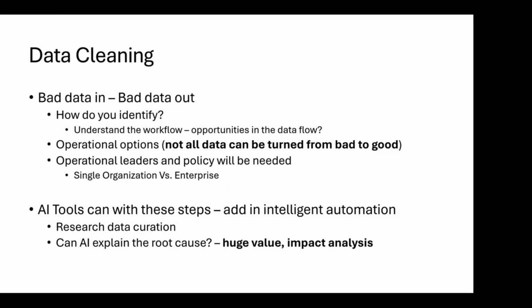Data cleaning, this big topic. When you're moving, say, I don't know, 10 million exams, there's going to be some very small percent, I hope, that is not the cleanest of all data. So if you pick up all of it and move it over, obviously some of it won't go. The big thing is, how do you identify that data? And sometimes this is a slippery slope or a black hole. Those are some common things that we've used to describe these kinds of things.